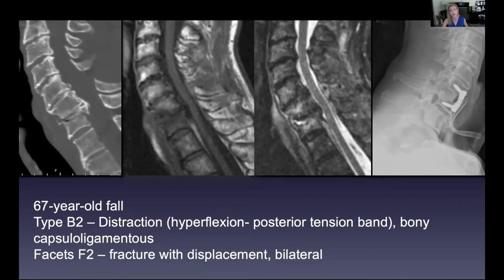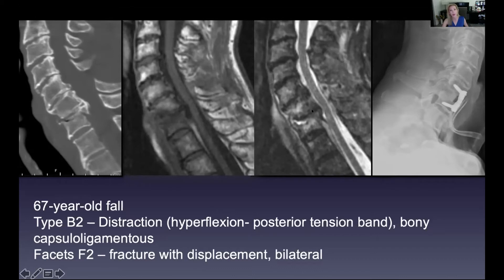In addition to the fracture and the unstable movement of the spine — broken with both ligaments and bones disrupted — in the last picture you can see edema in the bodies, edema under the anterior longitudinal ligament, and disruption of the posterior longitudinal ligament. All ligaments appear as black lines and must be continuous.